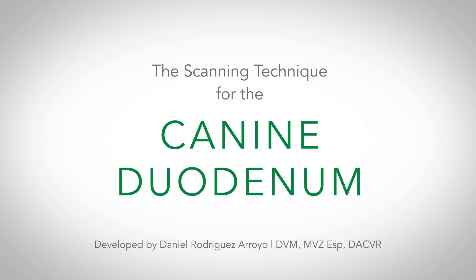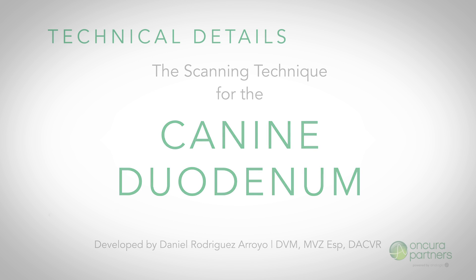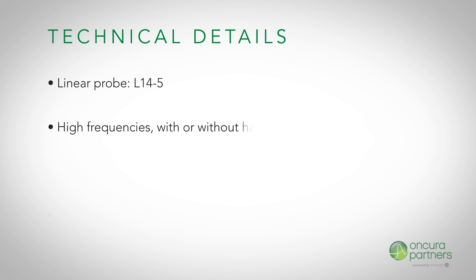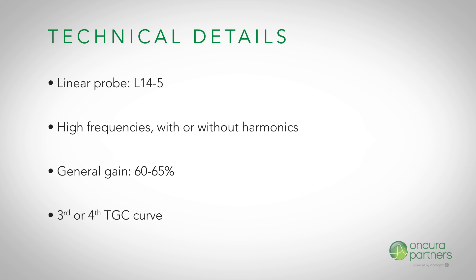The scanning technique for the duodenum in lateral recumbent canine patients. For this ultrasound, a linear transducer will be used at high frequencies with or without harmonics. The general gain should be maintained at approximately 60 to 65 percent, and the third or fourth TGC curve should be selected from the drop-down menu.